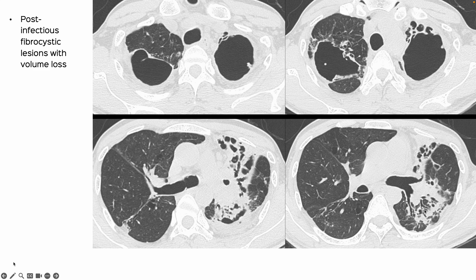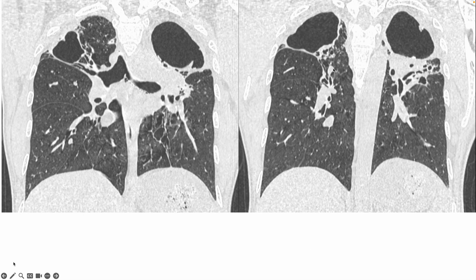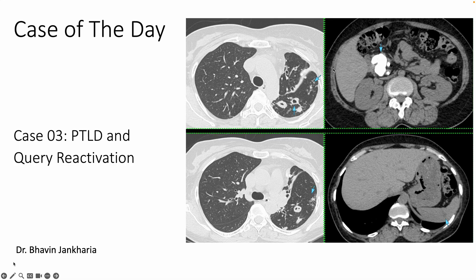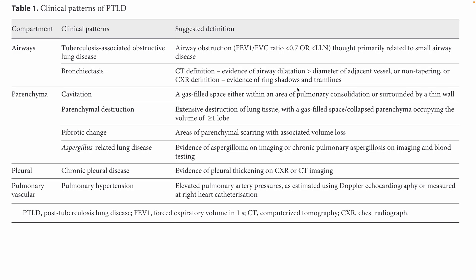These are the post-infectious fibrocystic lesions with bronchiectasis, extensive volume loss, large cavities, etc., also very well seen on the coronal images. I talked about this in the third case three weeks ago, where we had PTLD and suspected reactivation. PTLD, or post-tuberculosis lung disease, is the term we should be using for all such patients who have evidence of old TB in the lungs on CT.